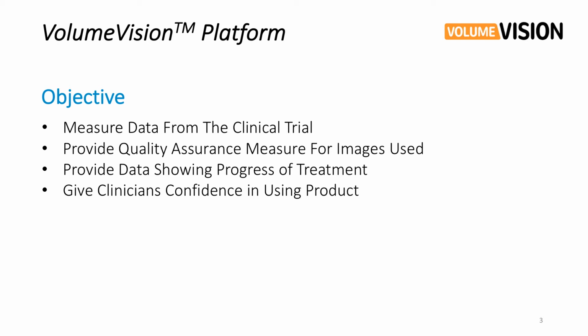The objective is to provide a software platform that can measure data for the clinical trial, both preoperatively and postoperatively. Also to assure that the quality of the input images is adequate to get this data, show the progress of the treatment, and then gather data so that we can perform a study that has validation and has enough objective data to be accepted in a major medical journal for publication, which will perform two functions. It'll provide more confidence for the clinicians and also drive widespread use of the product.